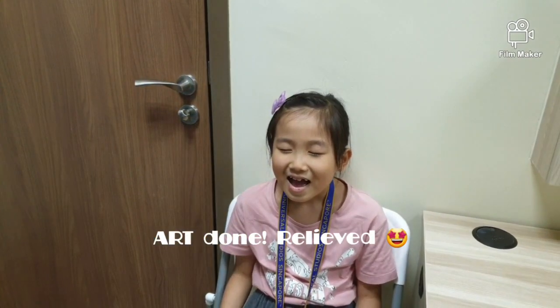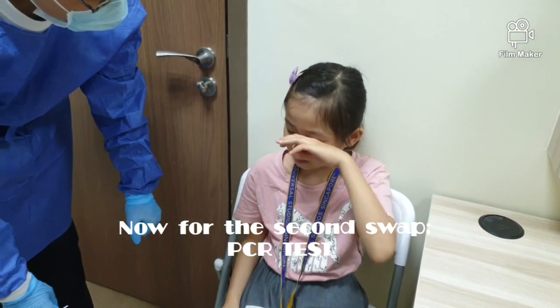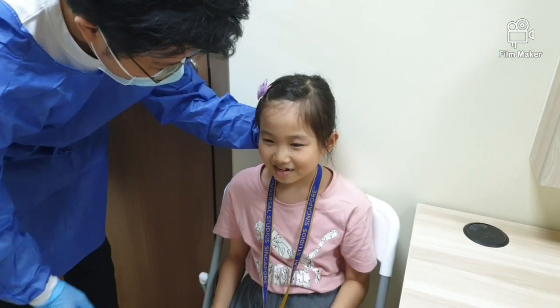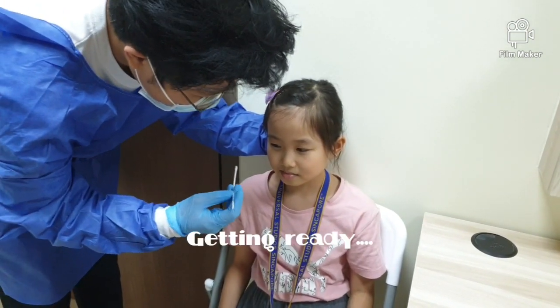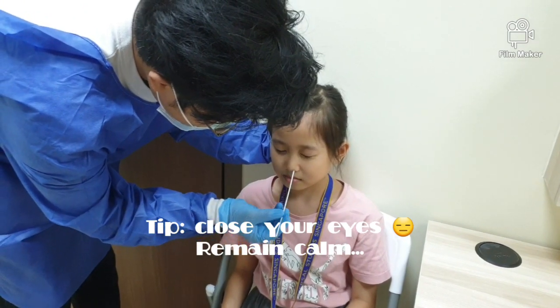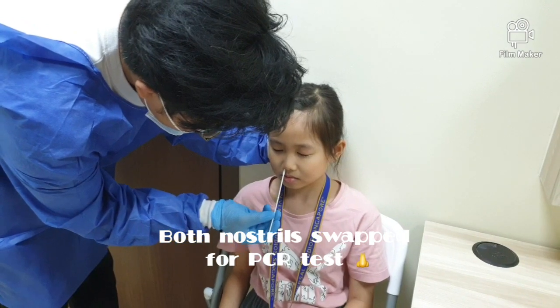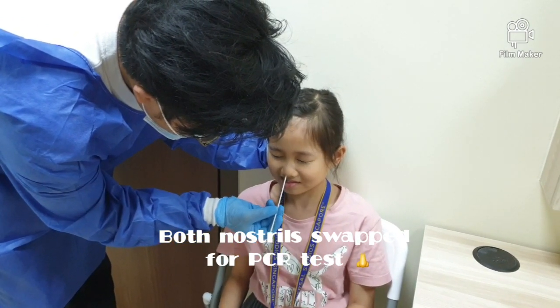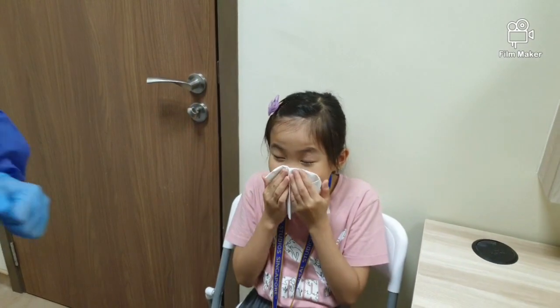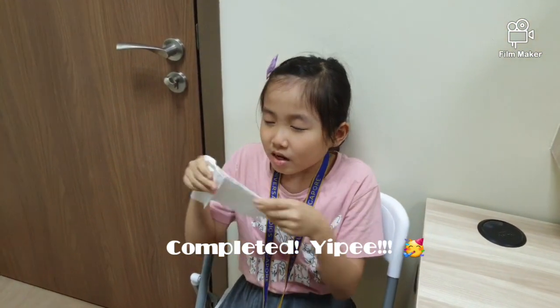Okay, ready? Okay. Again. Okay, last one. Don't look at it. Okay, that's it. Well done. Woo-hoo! That was beautiful.